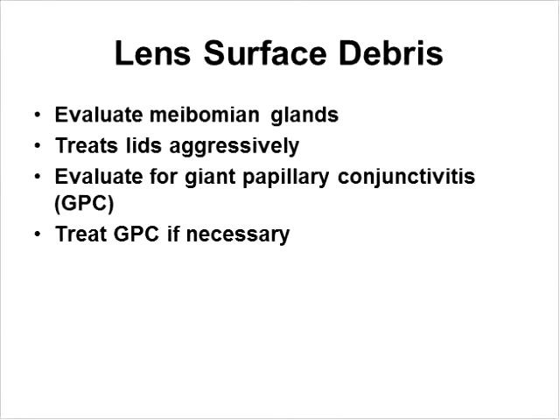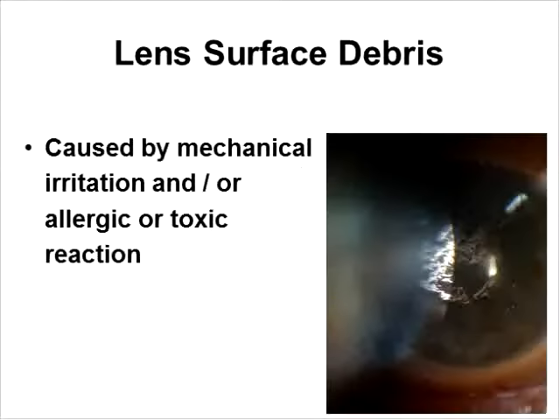There's also lens surface debris. Evaluate the meibomian glands carefully and treat the eyelids aggressively. Also, make sure to flip the lids and evaluate for giant papillary conjunctivitis, and again, treat if necessary. Here you can see a picture of debris on the lens surface.